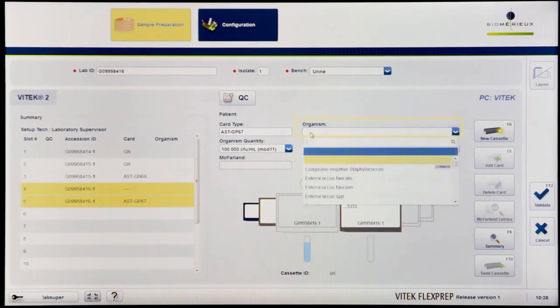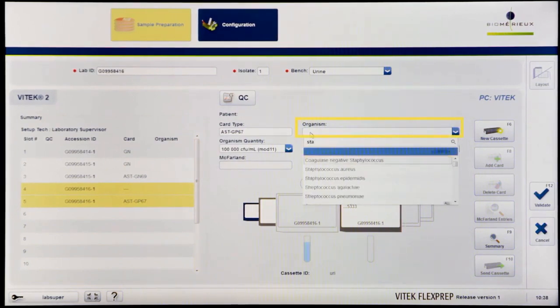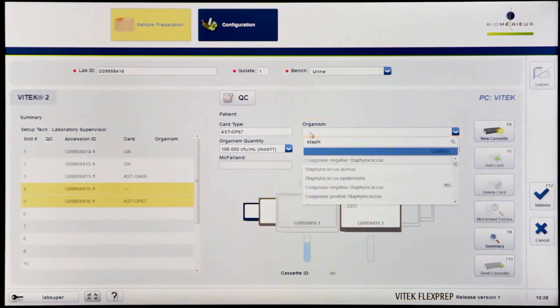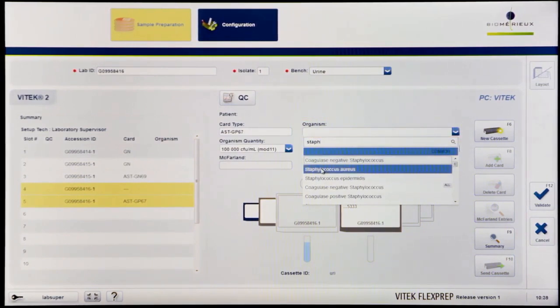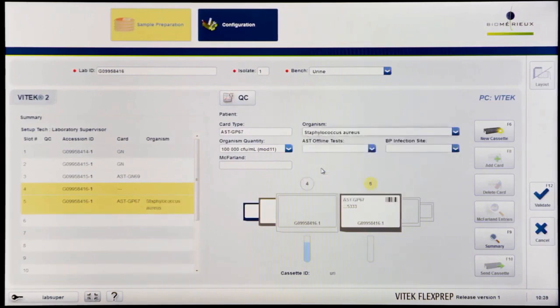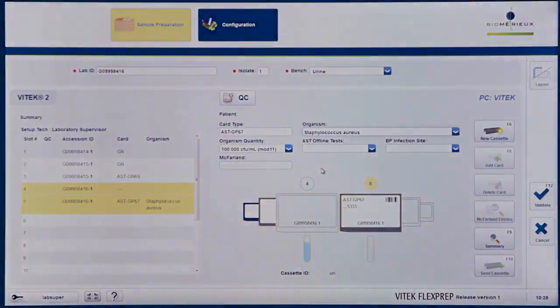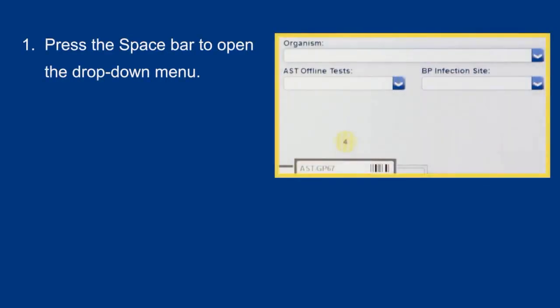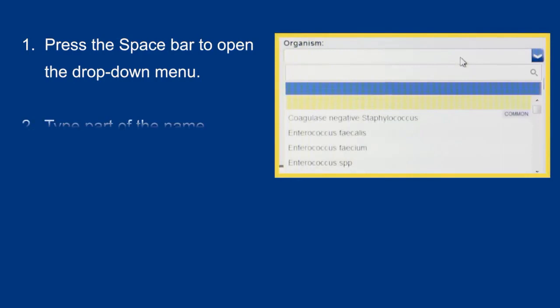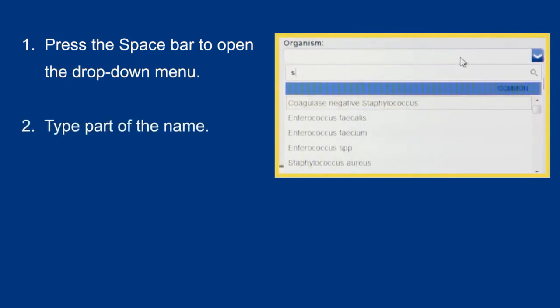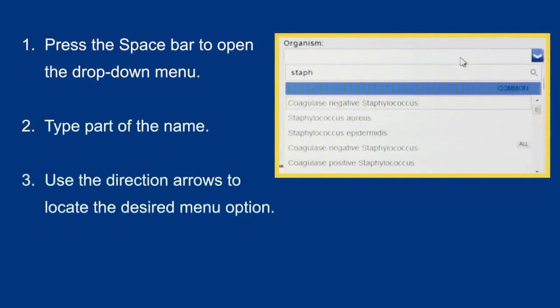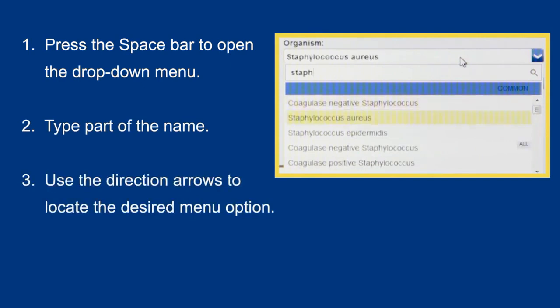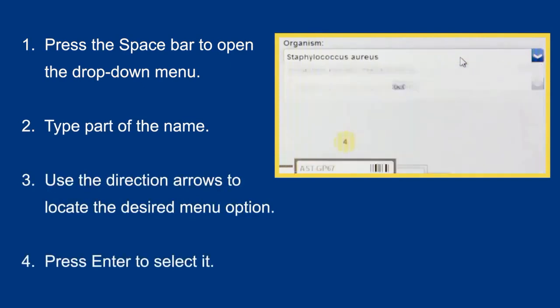Start typing any portion of an organism name and the drop-down menu will filter to the best matches available. Select the correct organism for the AST card from the Organism drop-down field. This may be accomplished most effectively by pressing the space bar to open the drop-down menu, typing part of the name, using direction arrows to locate the desired menu option, and pressing Enter to select it.